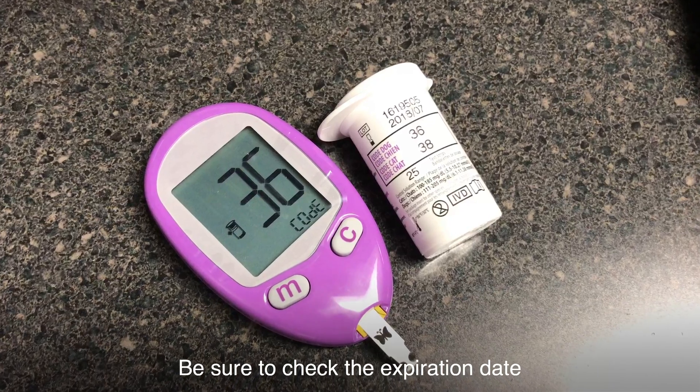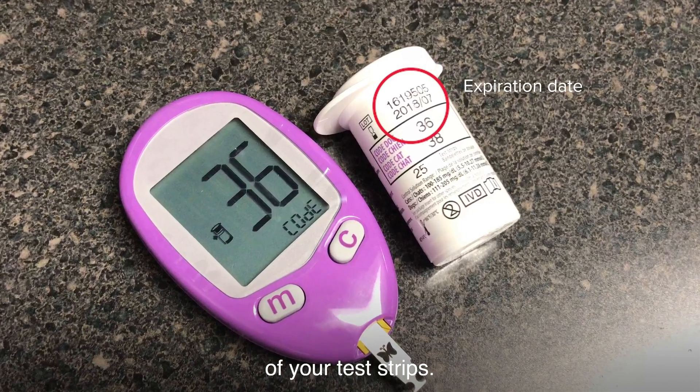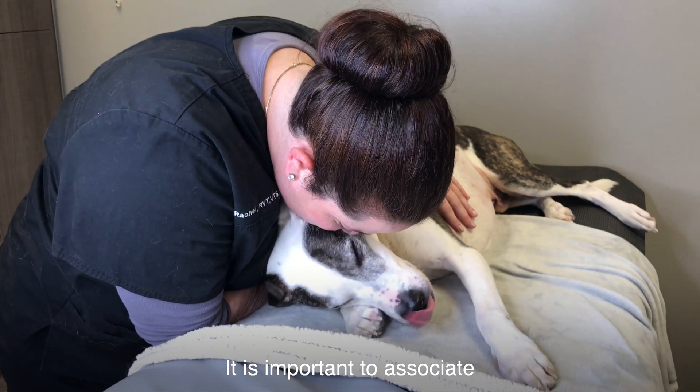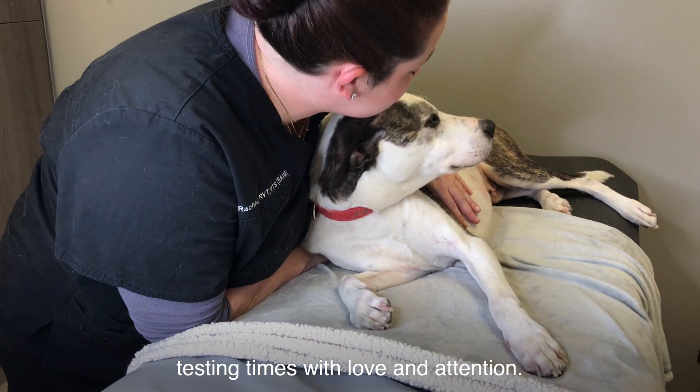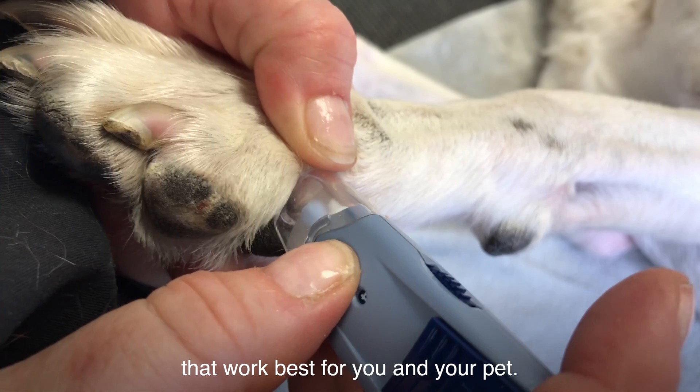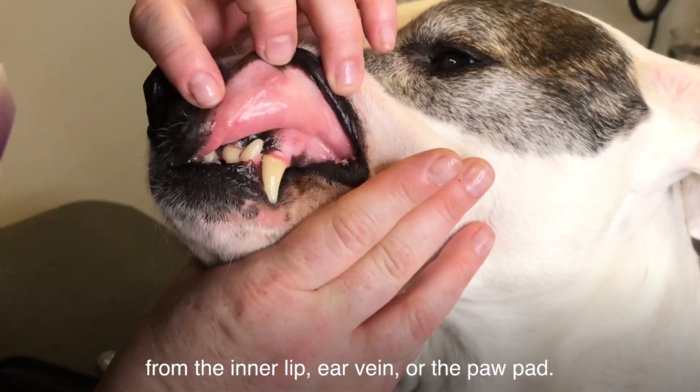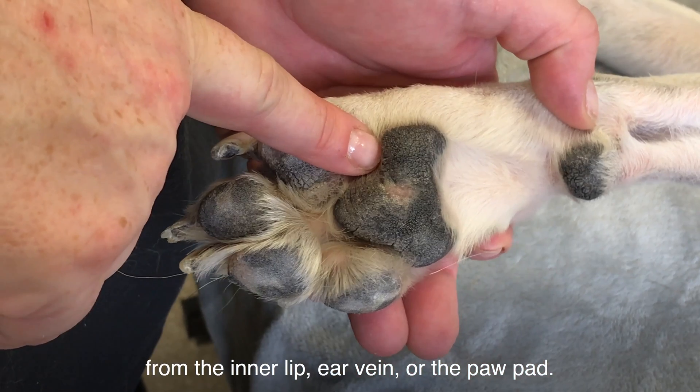Be sure to check the expiration date of your test strips. Next, find your pet and give him some TLC. It's important to associate testing times with love and attention. Over time, you'll find the testing sites that work best for you and your pet. For dogs, you can get samples from the inner lip, ear vein, or the paw pad.